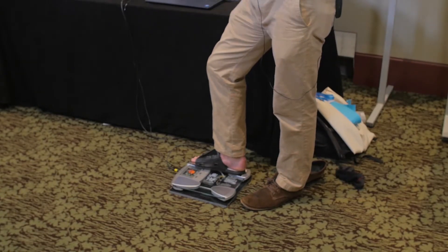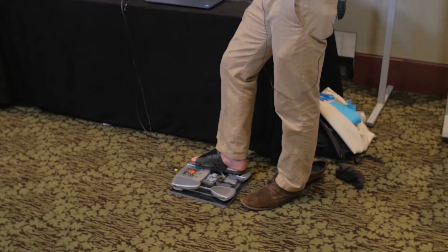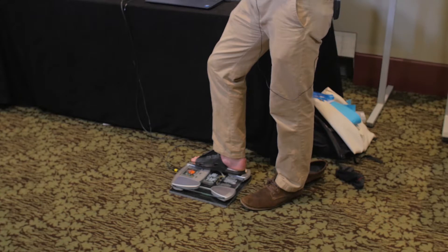Here's the current version of our system. As you can see, there's a foot strap over the dorsum of the foot that incorporates an array of PPG sensors, which gives you the distal timing reference. And the scale has strain gauges which, along with the analog front end, gives you that proximal timing reference.